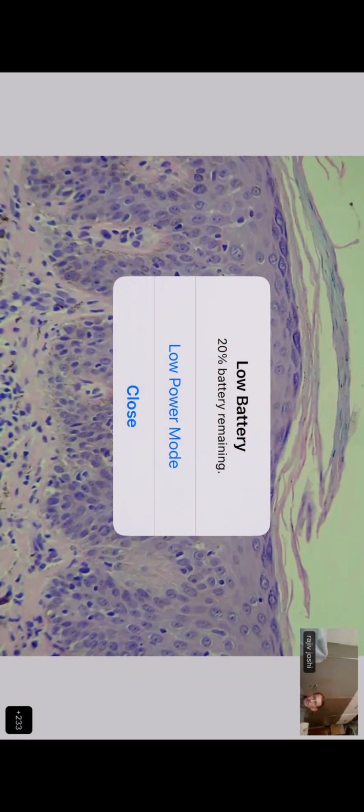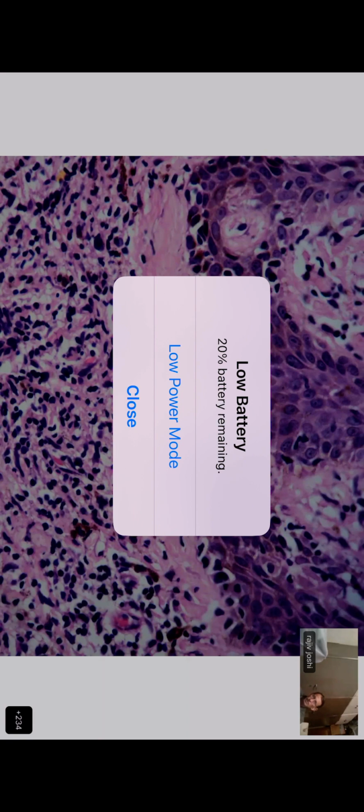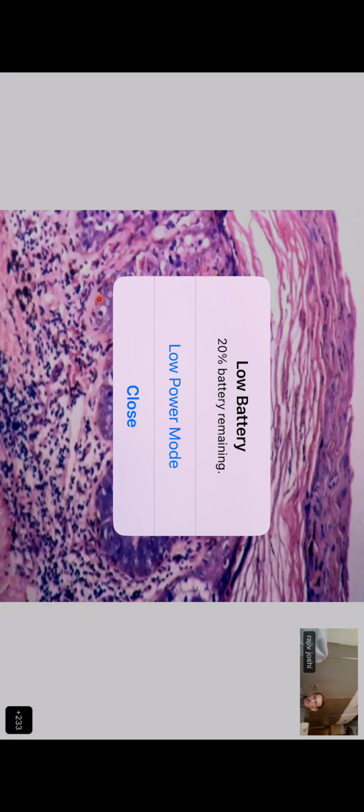Some of them are large within the epidermis without much spongiosis, with a well-formed granular layer and thin parakeratosis. Another example where you have psoriasiform hyperplasia, a lichenoid lymphocytic infiltrate, lots of melanophages, and lots of haloed lymphocytes all along the basal layer, the so-called tagging of lymphocytes. So this is patch stage mycosis fungoides. Another example where you get psoriasiform hyperplasia, broad parakeratosis, lichenoid infiltrate, and atypical cells: Bowen's disease. So all these can give rise to psoriasis-like cases.